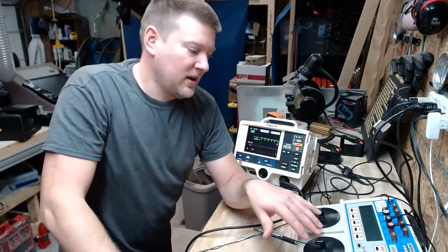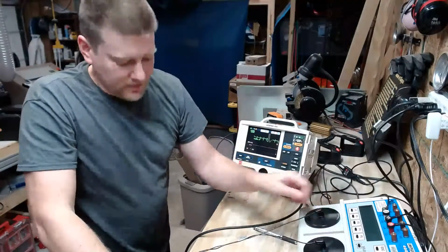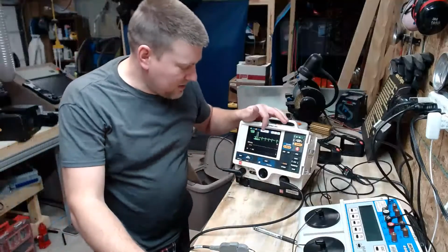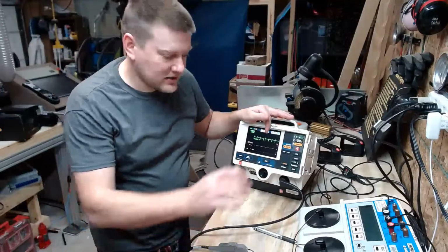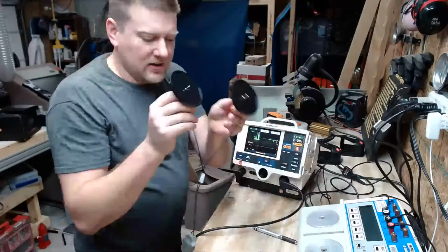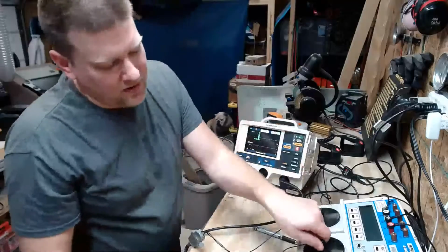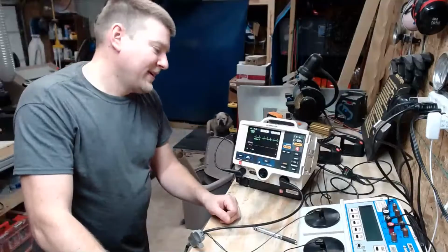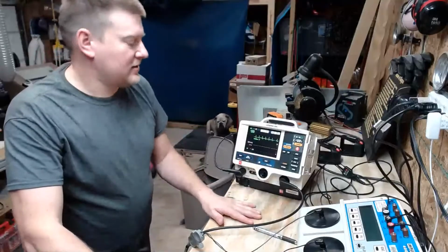So normally there is apex and sternum, and sometimes they're labeled. But if you ever walk up to a defib and you see that the waveform when it's on paddles is upside down, disconnect your adapters, flip them around, and get a standard waveform. That happens so often, guys.